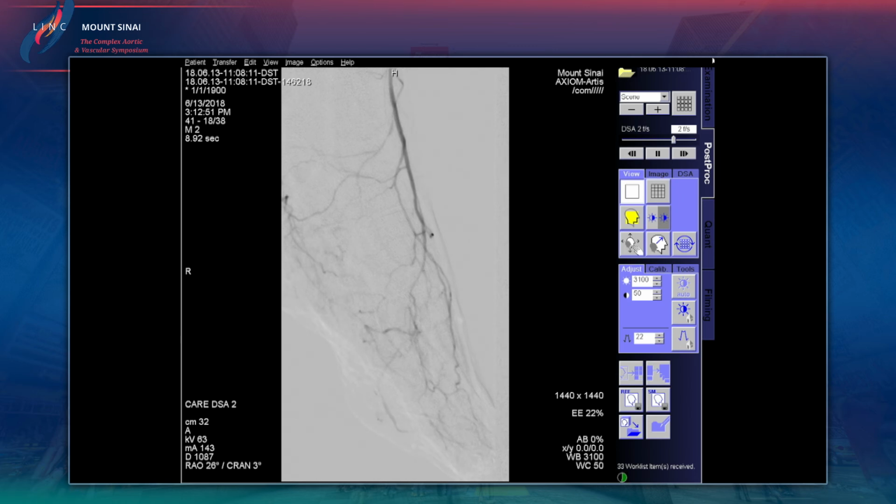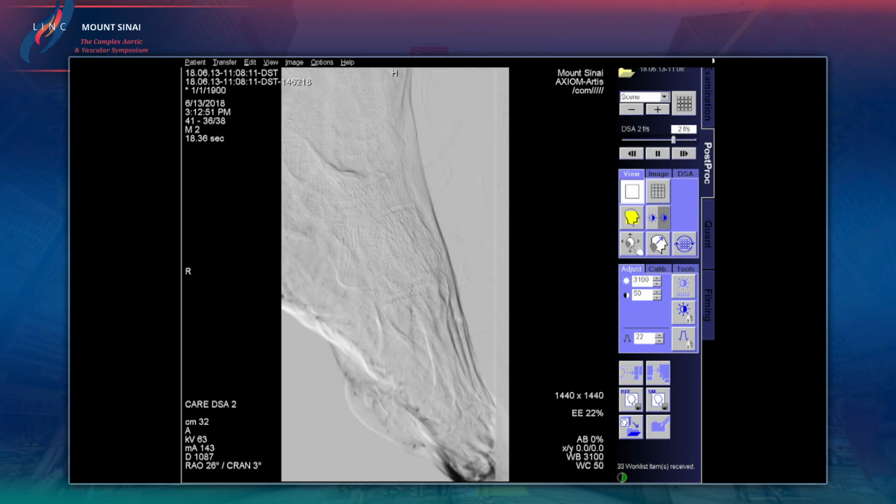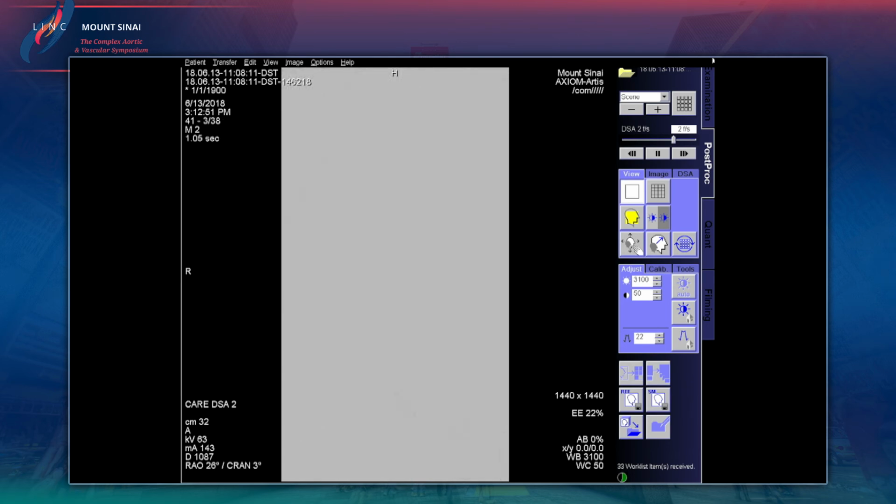Yes, sir. So before I go, I wanted to show you the final pictures. I think you have to take the camera into that room to show the last pictures from room 4, the case that we did through the foot. They have to come there to shoot it. So that we did the calcified tibial artery from the foot up, and at the end, when Dr. Coombe was our moderator, we were unable to show the final runoff.